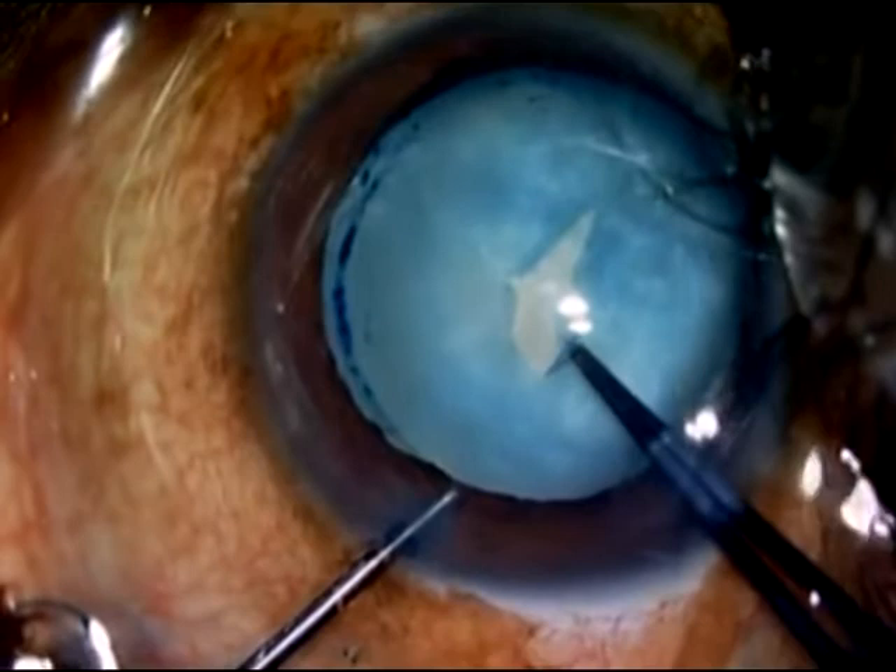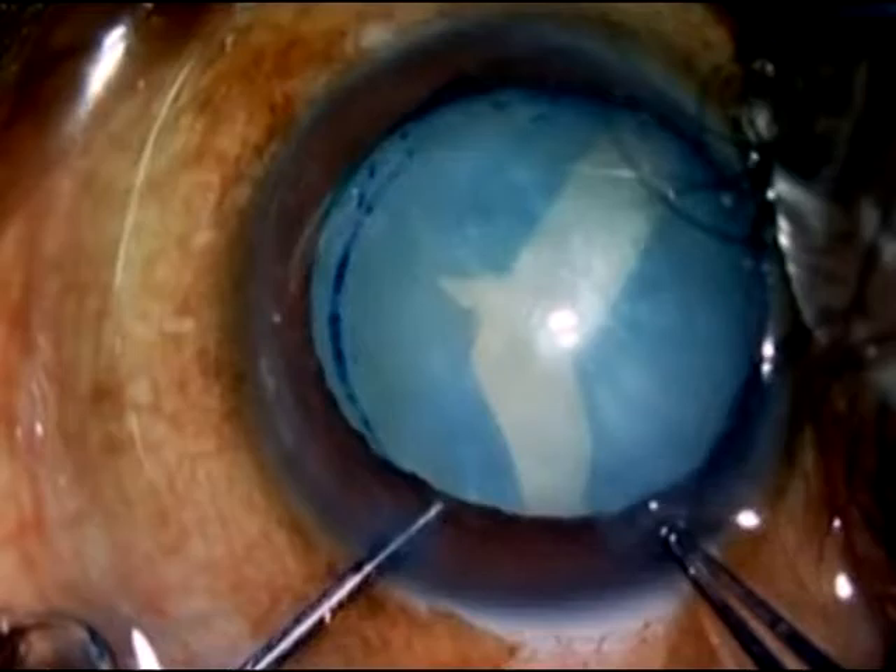The Argentina flag sign, wherein the rhexis gives way in two directions, is not uncommon in white intumescent cataracts. This Argentina flag sign can be prevented to a large extent by certain manoeuvres which will be shown in this video.